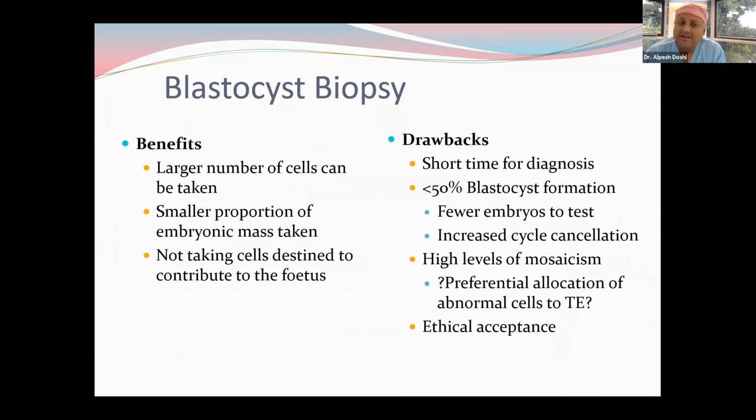Now, to focus on a bit of the pros and cons of blastocyst biopsy, of course, the benefits being that you take a larger number of cells compared to cleavage stage biopsy or even polar body biopsy. In the grand scheme of things, it's still a much smaller proportion of cells compared to doing a cleavage biopsy. For example, if you're going to be taking 1 or 2 cells out of a cleavage stage embryo, then you're essentially taking a quarter of the embryo out. So we know that cleavage biopsy does have an impact on implantation rates and blastocyst formation rates, whereas blastocyst biopsy has shown no impact on implantation rates compared to control population. And this was a very good study done by Richard Scott's group.